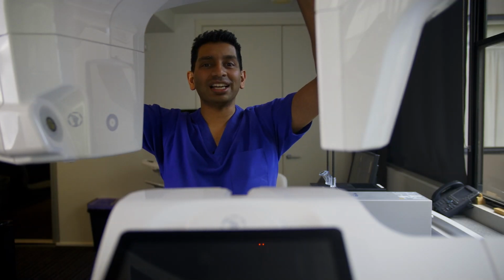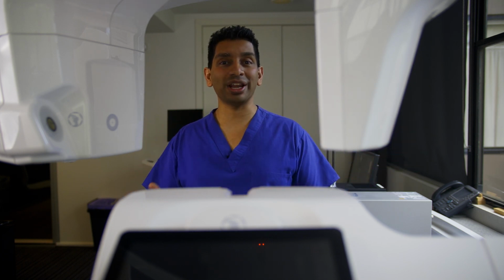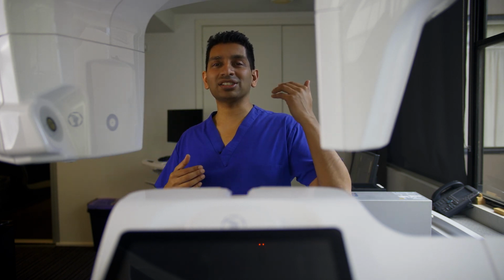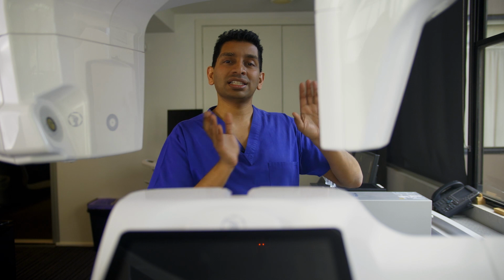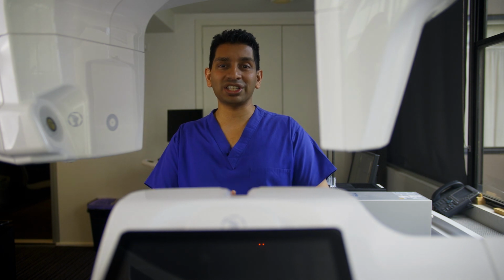One question that you might be asking is, why would you want to take an OPG when your patients can go to a radiography clinic and get it bulk billed and no extra charge to them? Well, there's a two-pronged answer to that. One is your time as a clinician. If you have to send the patient away, you have to tell them about the issue, send them away, get the information, come back, review that information again, and then give them the outcome. So you might be charging me again for a second consultation.